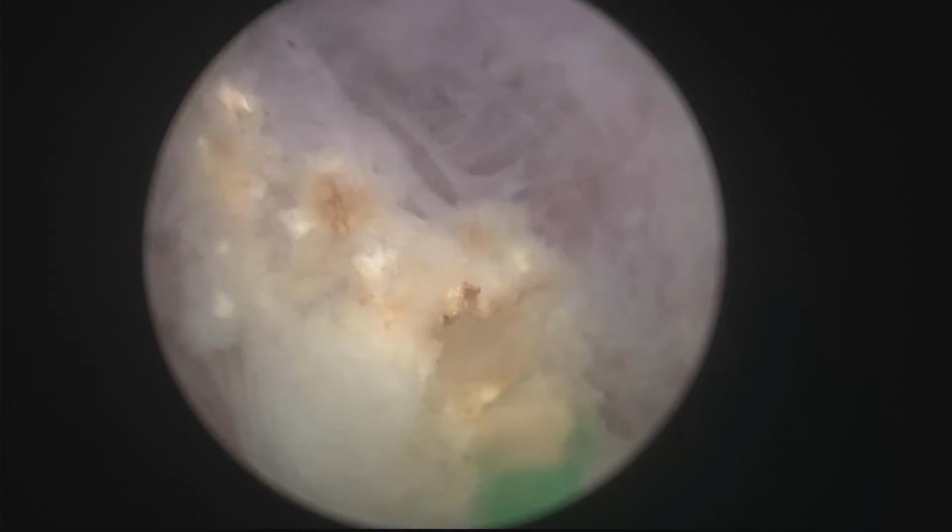That's the sphincter. We have managed to preserve the sphincter beautifully, and there is some minor residual bleeding. That's a small nodule, so I'm going to vaporize it. You see just below the nodule it looks a little bit flimsy, so you can spend some moments to make sure that you vaporize these small nodules like that. Some vessels going, not too much.